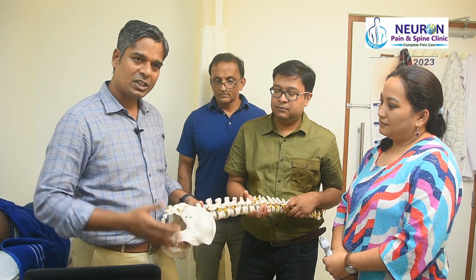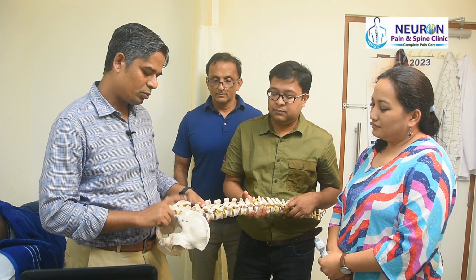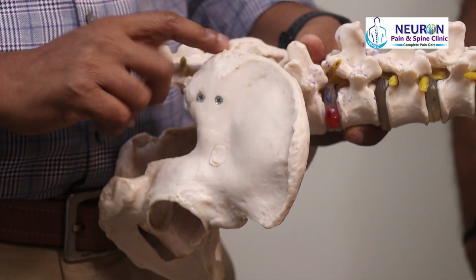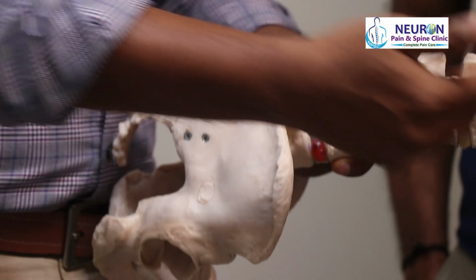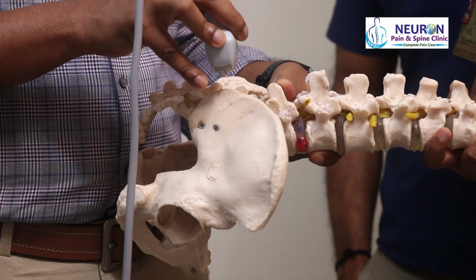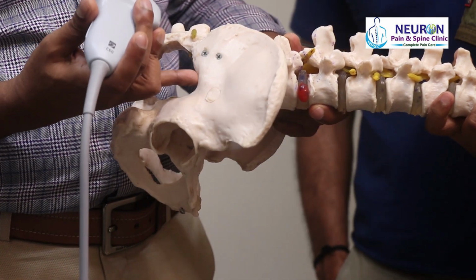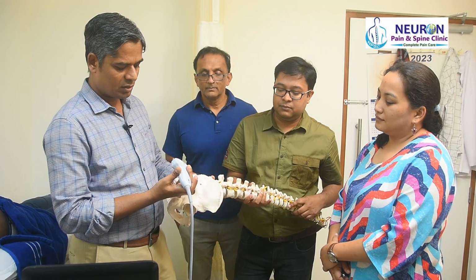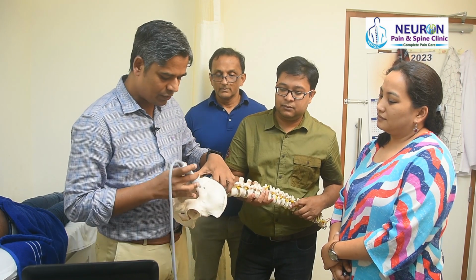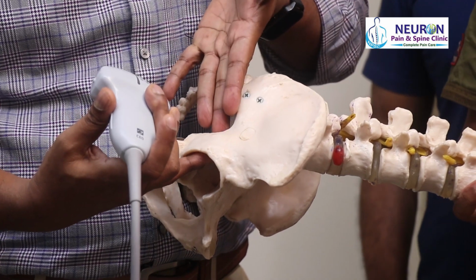So here I'll first explain that with a skeletal model. My step 1 scanning technique is going to be putting my probe over the posterior superior iliac spine, PSIS. So this is the iliac crest; when I put it over here, I take a low frequency curvilinear probe. I first scan in a transverse plane, slowly move down in this plane till I reach this area of the pelvis, that is called the greater sciatic notch. So once I reach this area, this area is occupied by the piriformis muscle.